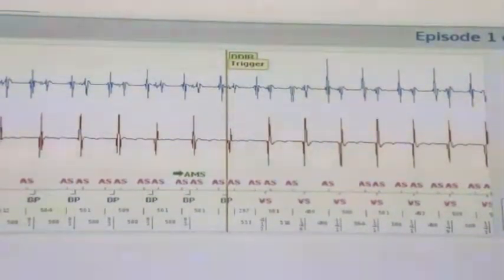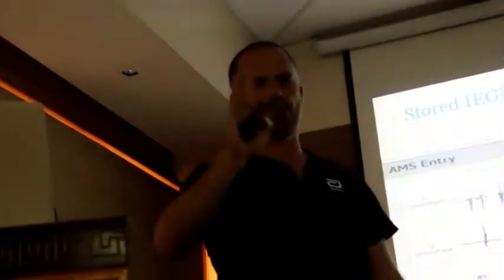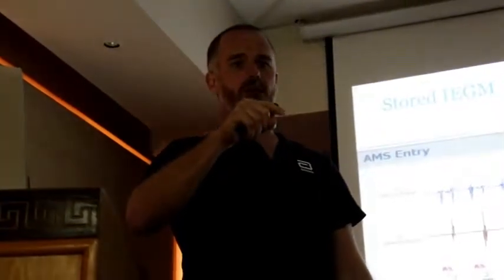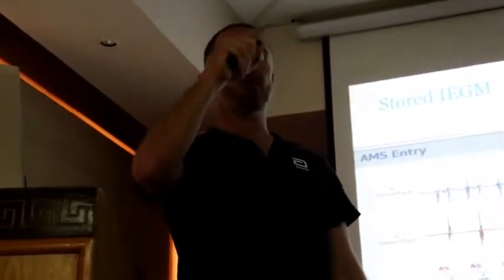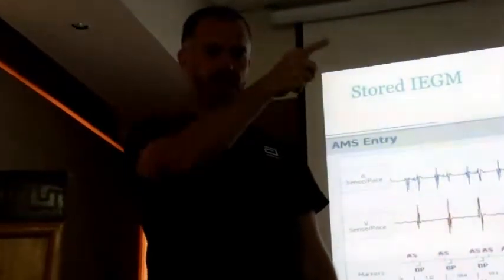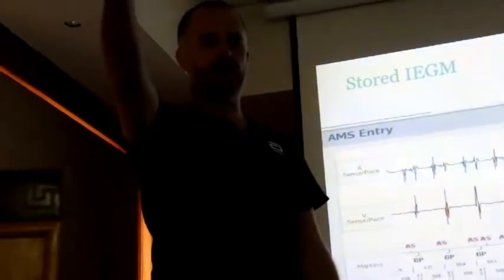So you'd have to be really insensitive on your atrial channel, and then if you went into real AF, with all the change in cycles, you'd miss loads, and you probably wouldn't mode switch. So really rare. There's only one time, and it happened 6 weeks ago, where I've had to change the decay delay threshold start on an atrial lead, and it was for far field P wave oversensing. So the atrial lead sensed the right atrial signal, and then it sensed the left atrial signal.